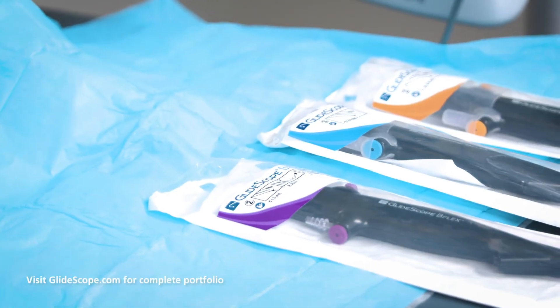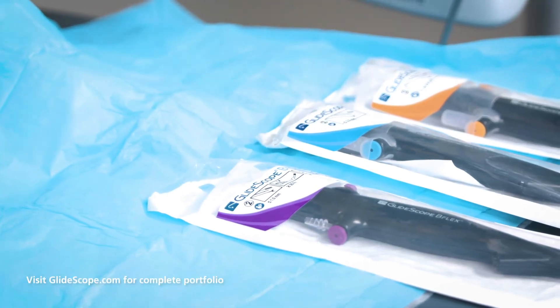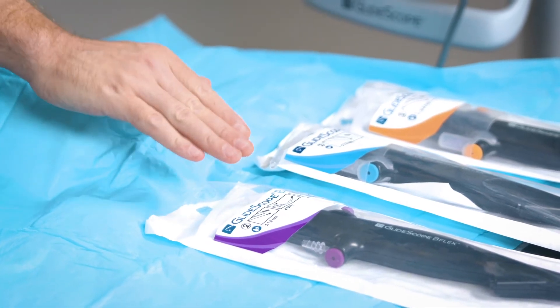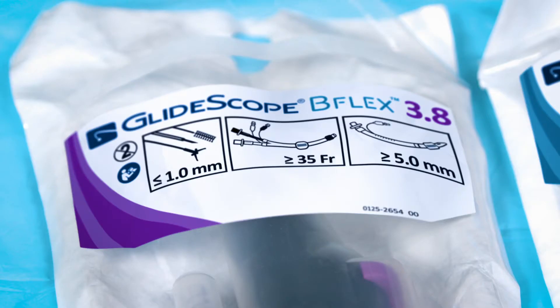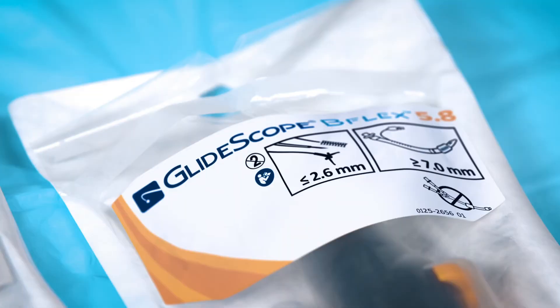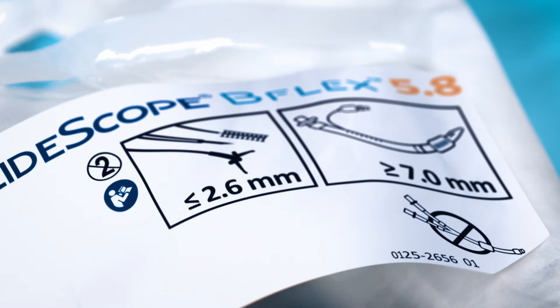Moving over to choose our bronchoscope, we can see that the B-Flex has three different bronchoscopes to choose from, which are color-coded according to the diameter of the insertion tube: the B-Flex 3.8, 5.0, and 5.8. Today I'll be using the largest, the B-Flex 5.8, which has the most powerful suction. Note that the packaging tells us that this requires at least a 7.0 millimeter endotracheal tube or larger to accommodate the diameter of the insertion tube.